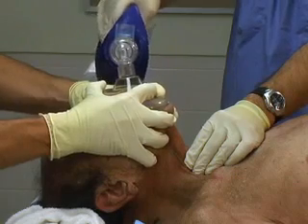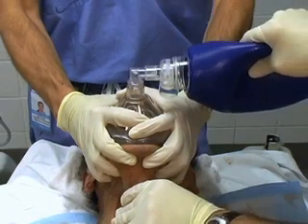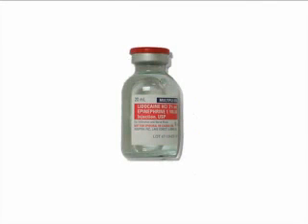Place the patient in the supine position. Since this procedure is performed in extremely urgent circumstances, there is not time to drape the patient. Chlorhexidine or betadine should be applied if time permits. If the patient is awake, administer local anesthesia.